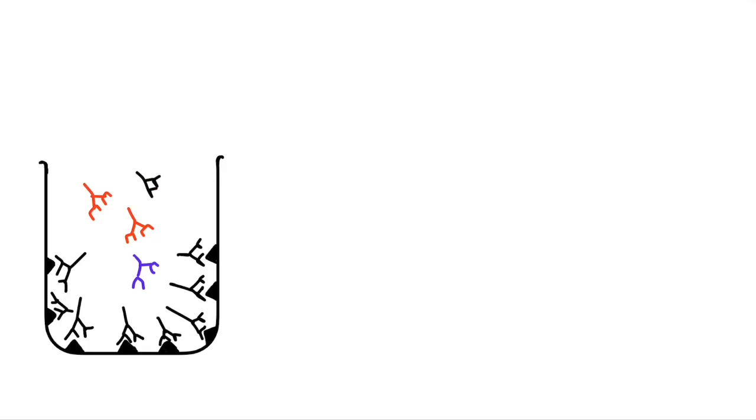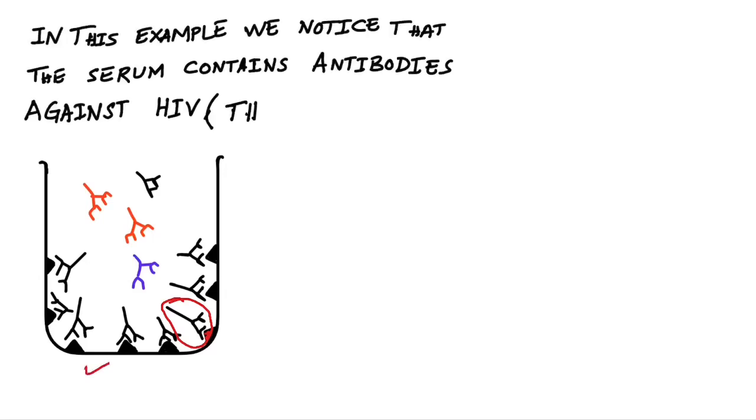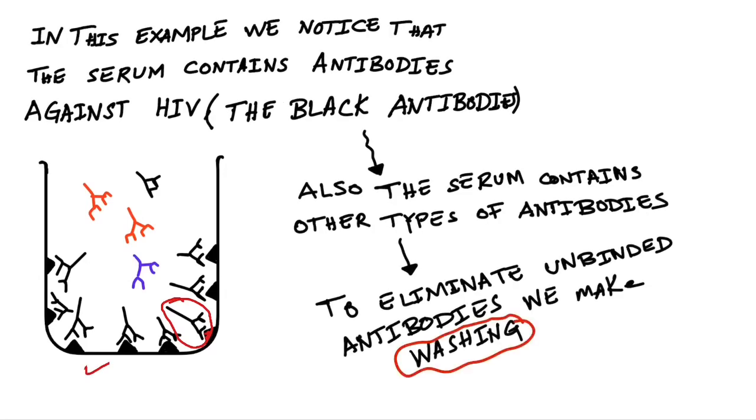Based on this diagram, we notice that there are antibodies that bind to the fixed HIV, which means that this patient is affected. But can we stop here? Can we conclude that this person is affected based on the diagram? As we see in the first diagram, the wells are not large like this diagram. Okay, then we have to read in this example.